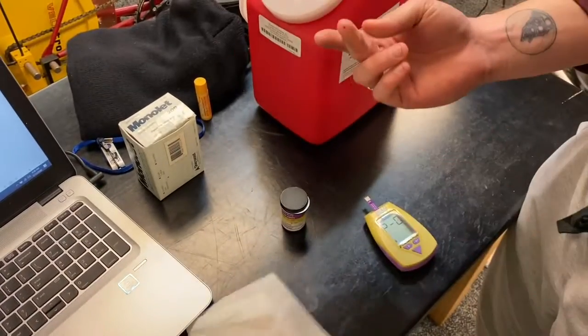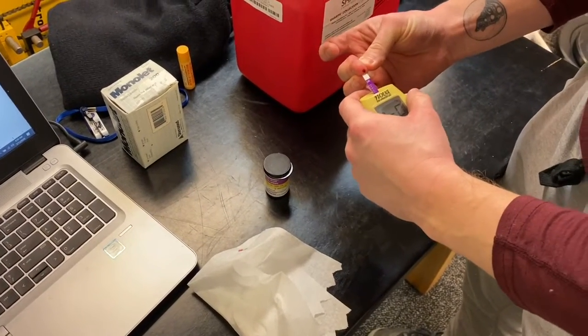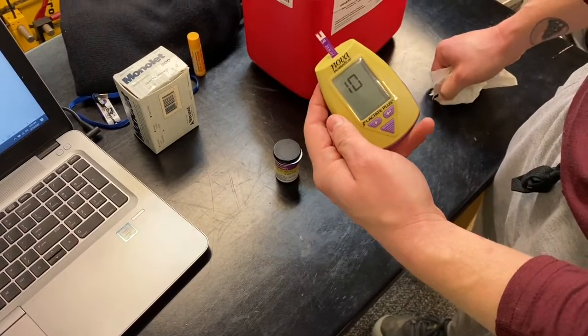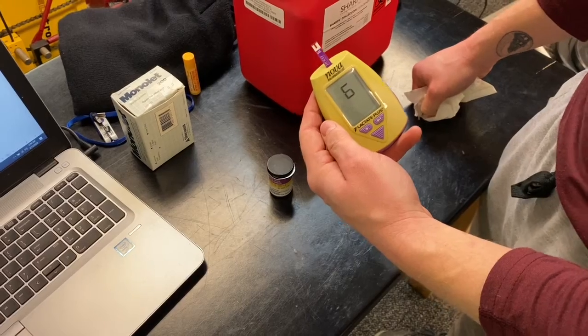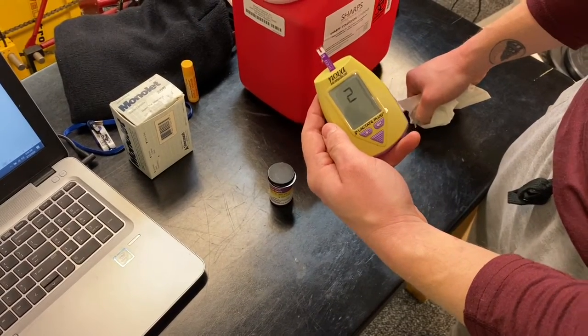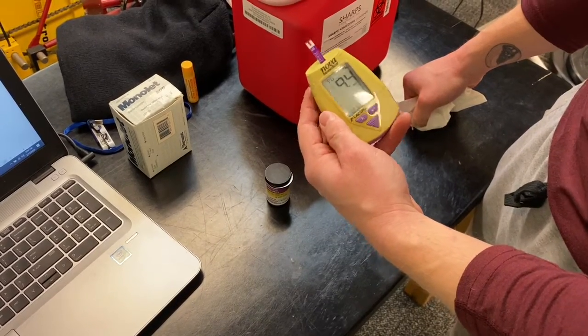Then you take a little lancet and poke yourself in the finger — just some capillary blood. You wipe off the first strip, put it into the lactate analyzer, and it takes about 13 seconds for it to tell us how much lactate is in the blood. If I remember right, it's like 9 something — 9 millimoles that I got, so I was trying to kill myself. All right, 9.4. See you in class.